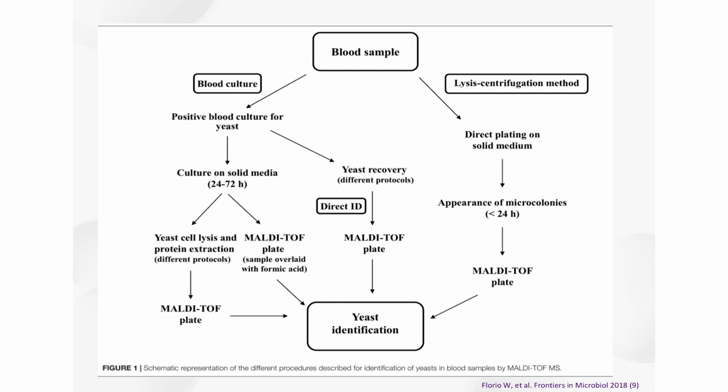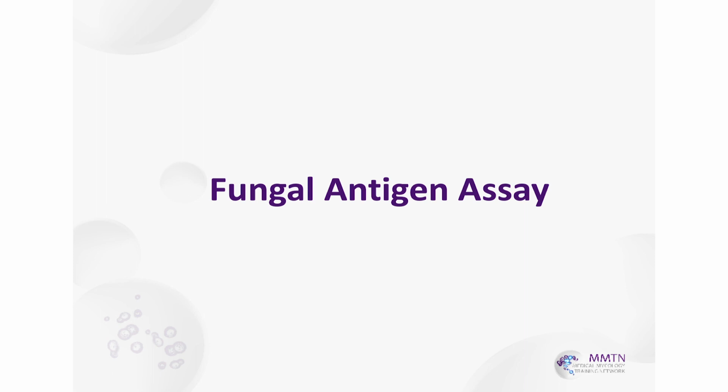So shall we shift from MALDI-TOF to antigen? As you know, normally for mold, we will detect antigen or antibody. Everyone's sleeping. What are we going to detect, antigen or antibody? Help me, please. Antigen. Thank you, Jiong. Yes, we are going to detect antigen, because antibody is not so active.